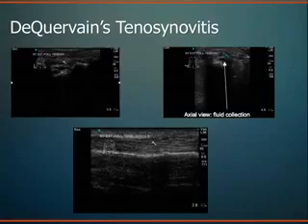So this is De Quervain's. Some of these images are a little bit old from my fellowship training, but what you're looking at here is the deep bony cortex through here, and the joint space here. This is the overlying tendon tissue, the extensor pollicis brevis, which is part of that De Quervain's complex you guys will learn about more in the coming years. The EPB is one of the tendons involved in De Quervain's. You can see it very nicely, very superficial.